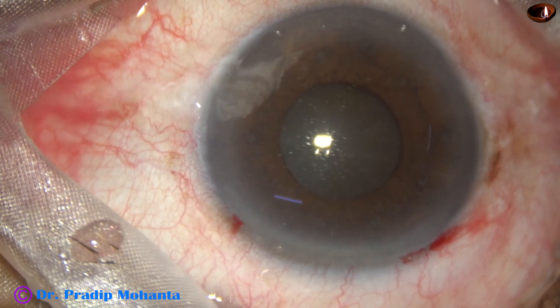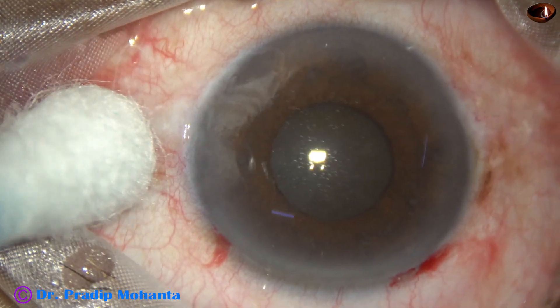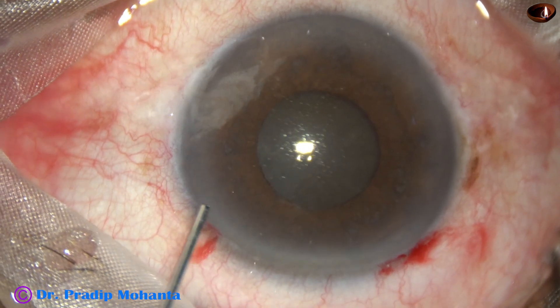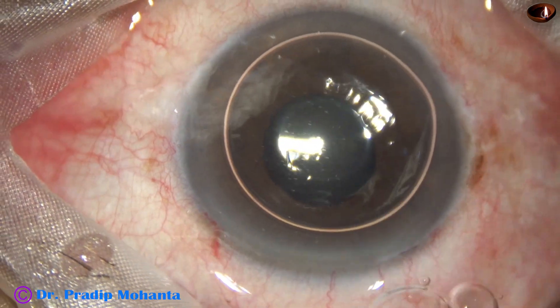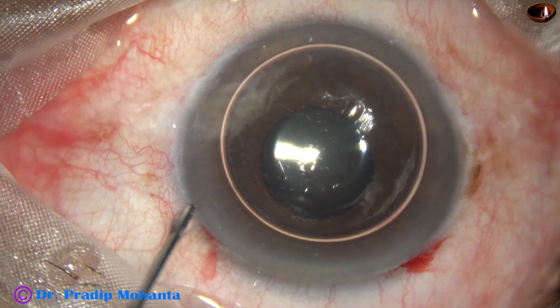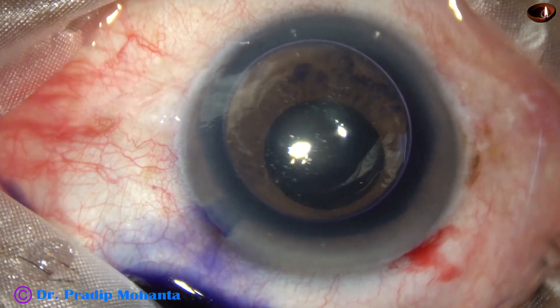I have taken up this case for surgery. The surgery is minimally edited and it is going to take a long time. The surgery time was 20 minutes; it has been edited to 16 minutes, minimally edited. If you want to watch the full surgery, you have to make time and watch it carefully.